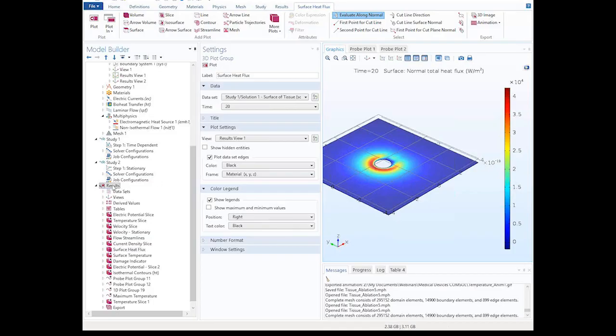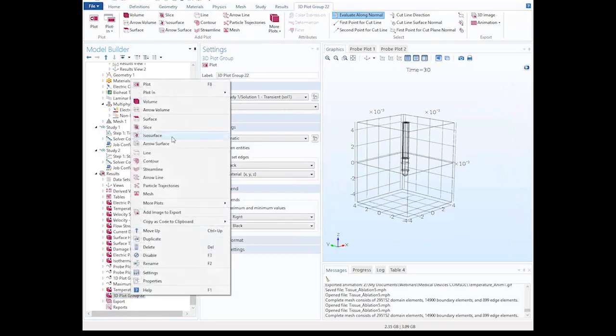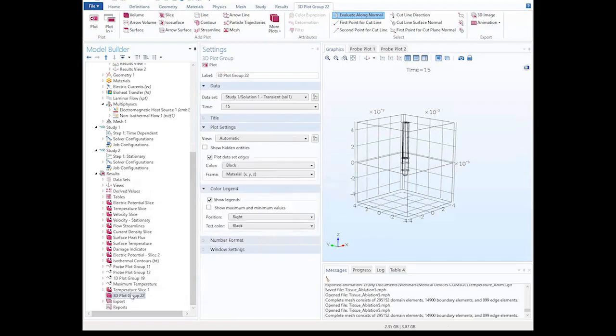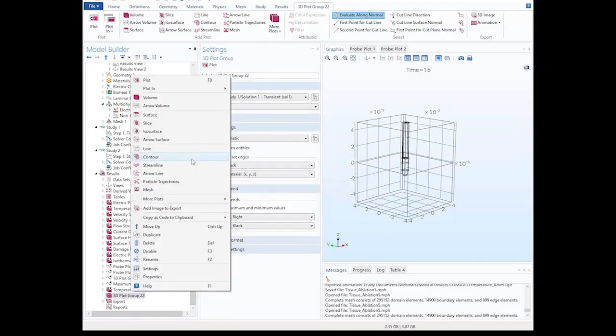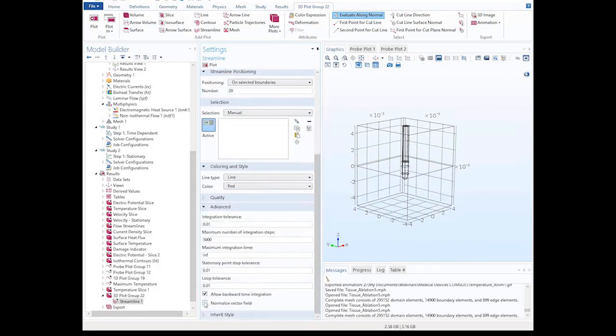And I'll show the ease of creating plots by creating one more. Let's say at time 15, we want to look at a volume plot. No, sorry, let's delete that. We want to look at streamlines, let's say. So streamlines of current, moving forward only, and starting on the surfaces you see highlighted here. The current that starts here, how is it going to flow? That's basically what I'm trying to see. And you see it flows out this way.